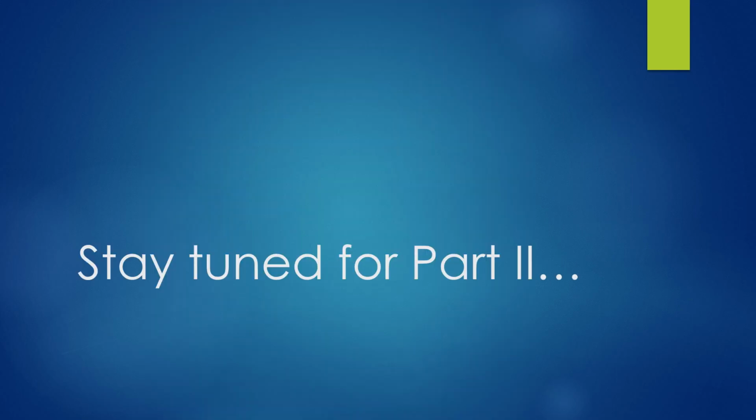That concludes part 1 of FDG imaging for oncology. Please watch video 2 for part 2, which includes all of the imaging review and how different diseases will appear on the FDG imaging, as well as normal and abnormal variants.